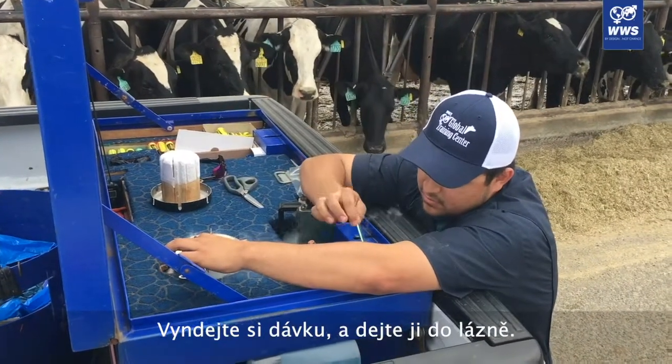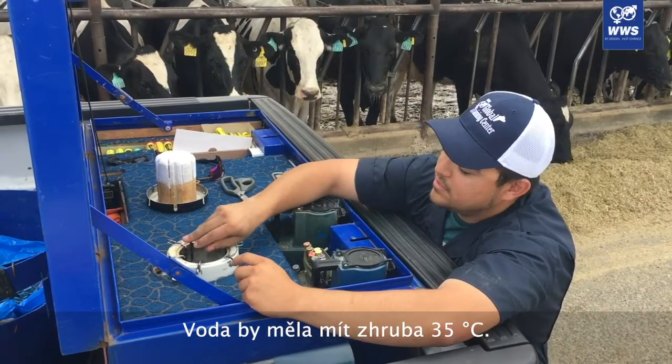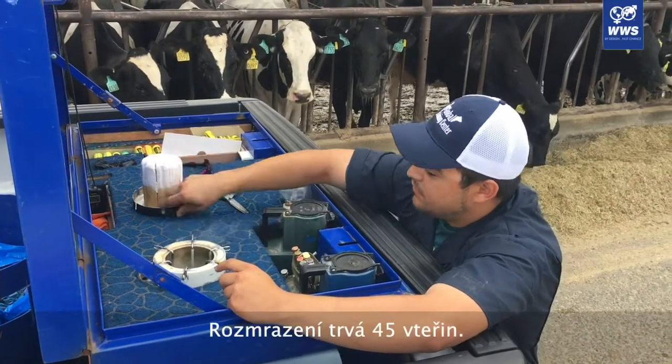Pull it out, drop it, put it in the water. Speed of 95 degrees, around 96. Let it thaw for 45 seconds.